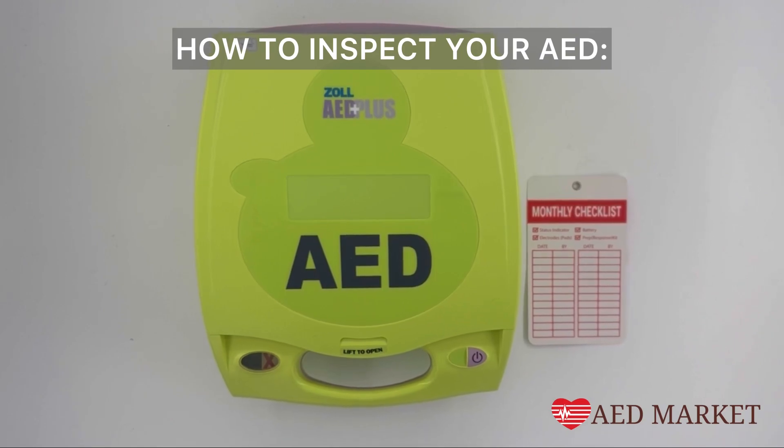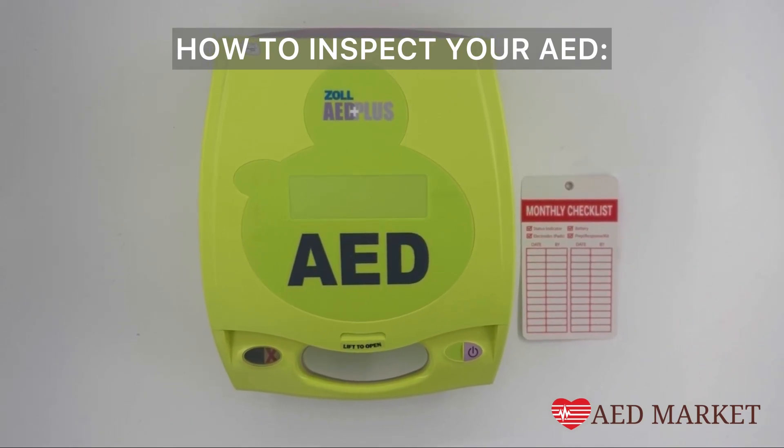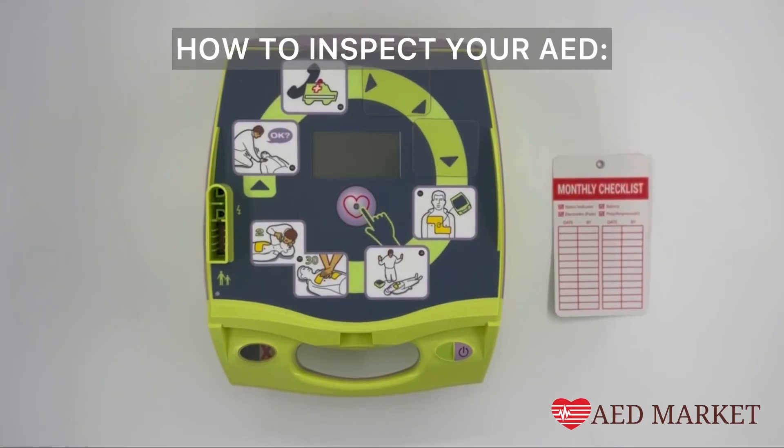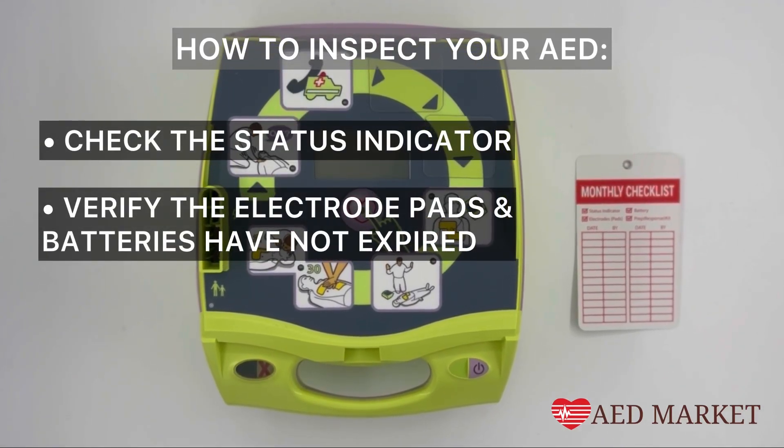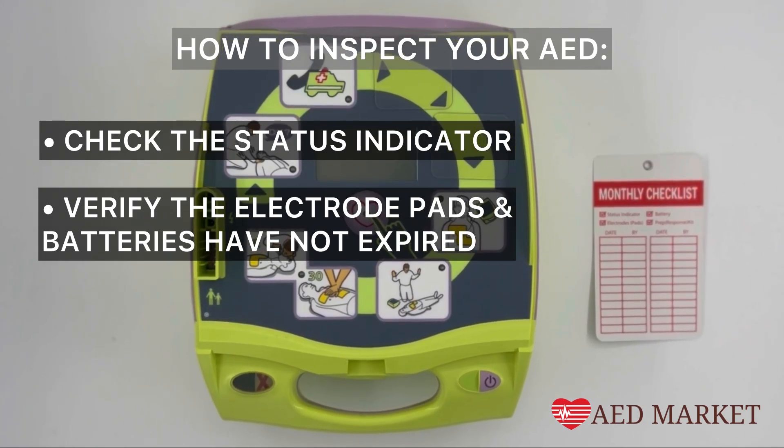Let's go through how simple it is to verify that your Zoll AED Plus is rescue ready. The most critical inspection tasks involve checking the status indicator and verifying that the electrode pads and batteries have not expired.